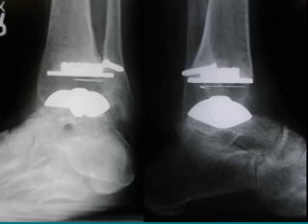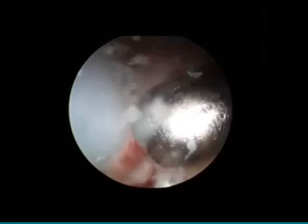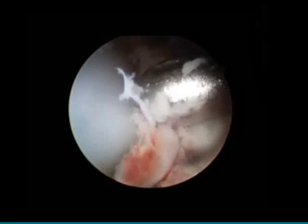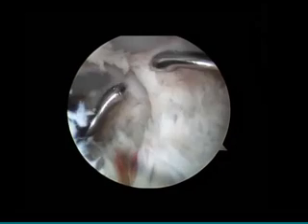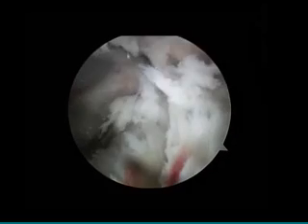Sometimes you just got to keep trimming away the bone and putting a prophylactic screw in. But nonetheless, we have this situation, and we want to try to help her. I have gone in arthroscopically. Now here you see a shaver going in and removing the soft tissue, and then I'm trying to find the malleolus here, and that's not always easy with the curette.